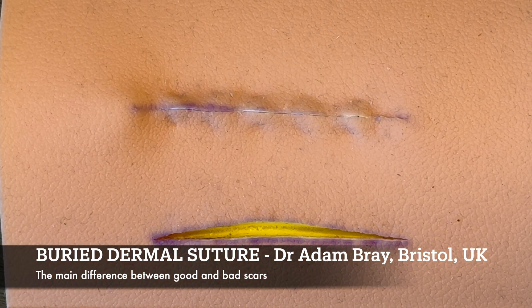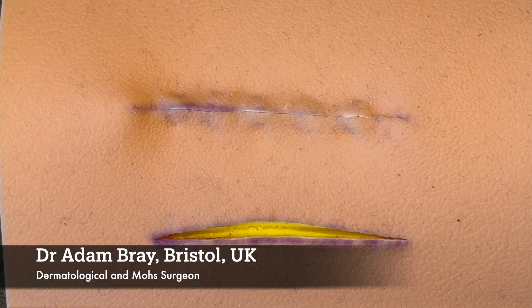I want to show you the most important stitch. This is the key stitch you need to know to make wounds heal nicely and to get the best scars. If you don't get this right, you can't get it to heal nicely, and what you do on the surface is of much less importance than the buried dermal stitch.